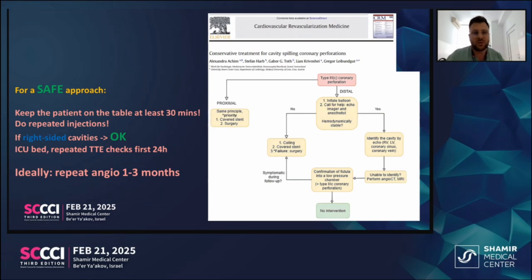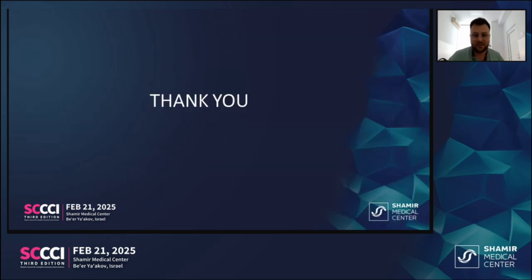It's always good to keep the patient on the table for at least half an hour, and do multiple injections. Make sure that the perforation is stable, and TTE checks the first day. And of course, if you want to call him back, it's always good to repeat the angio just for your own comfort, to see that the perforation is closed. Thank you very much.